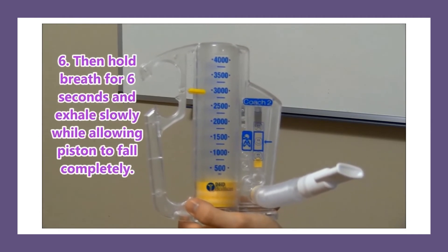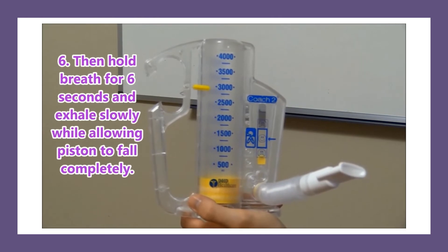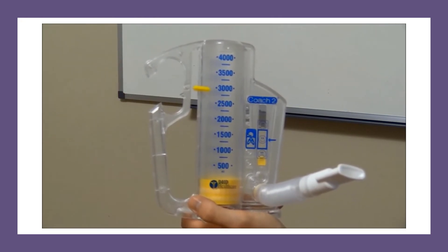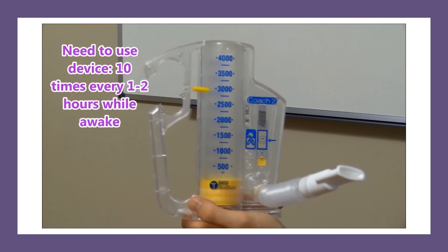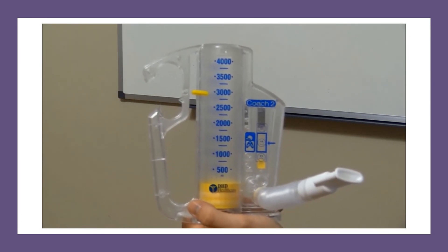Then they'll need to hold their breath for six seconds, and then exhale slowly and allow the piston to fall before repeating again. Record the amount that they were able to get on the incentive spirometer. They will perform this at least 10 times every hour or two while awake. This is what it looks like in action.